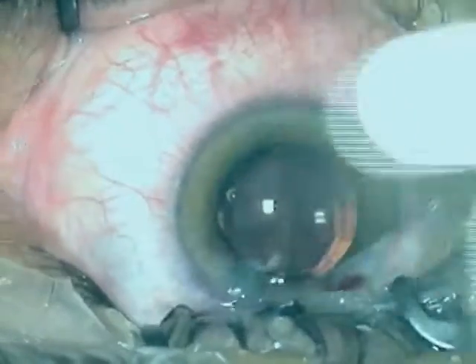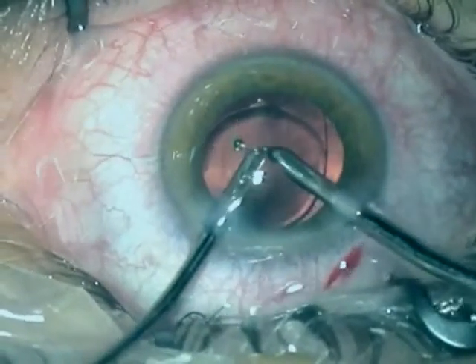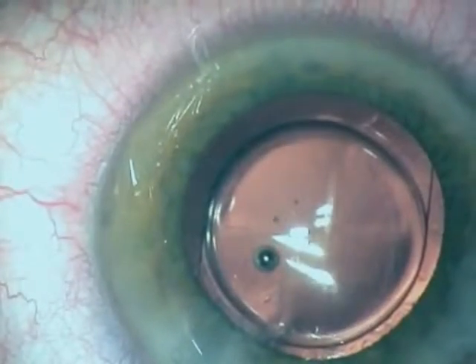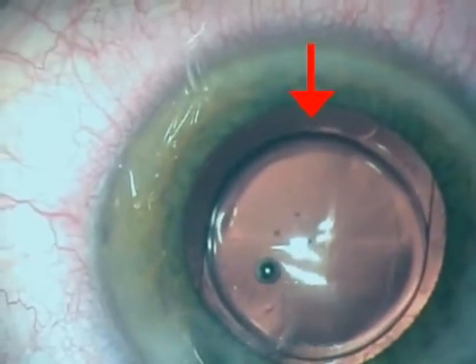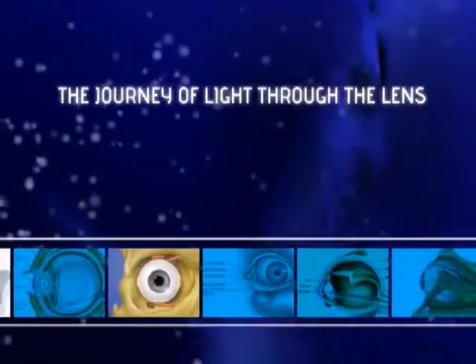The total surgery is performed through incisions of 2 mm. Then the viscoelastic is removed and the surgery is finished. This is how the lens looks at the end of the surgery, with the sectors indicated with the lines and the notch, which means that the lens is correctly placed inside the capsular bag.